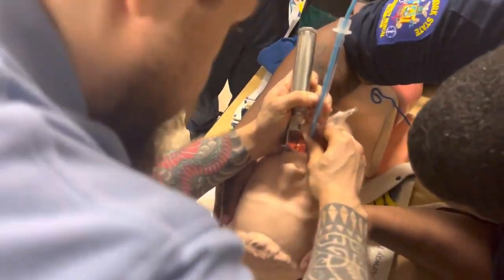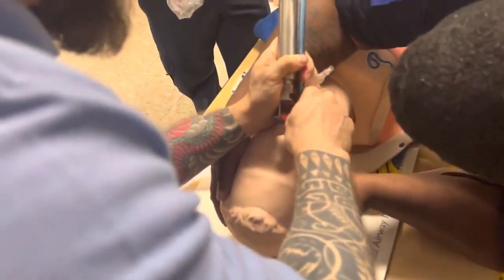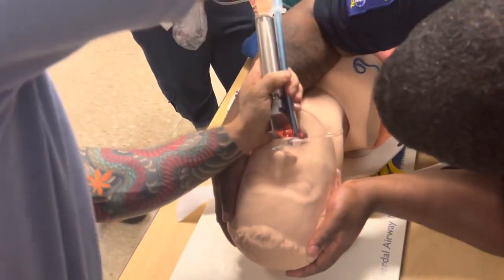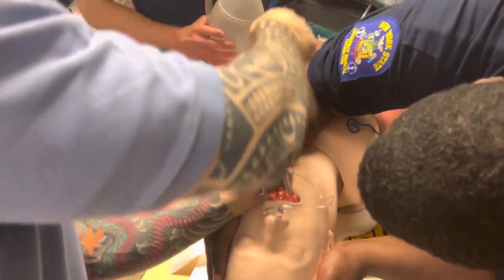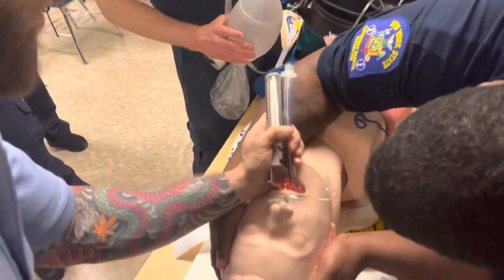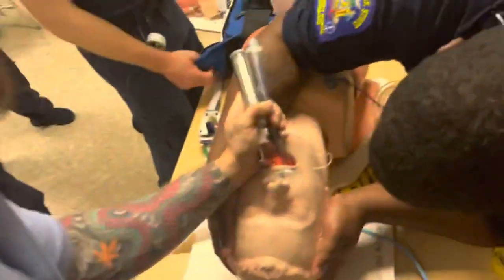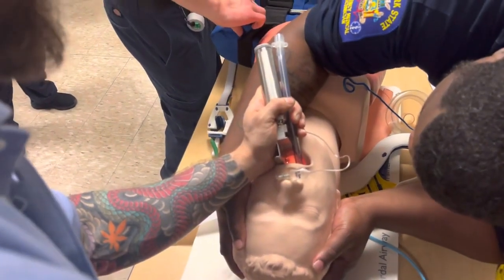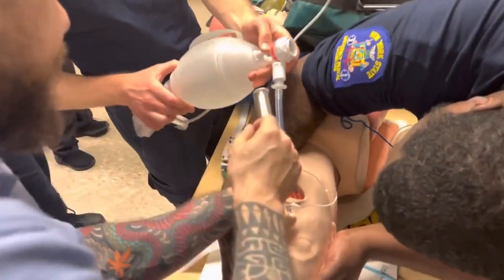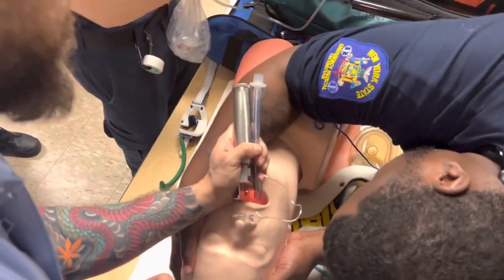That's all right. So I saw it go through, right? And now what I'm going to do is when I take out my bougie, I'm going to do it anatomically towards the feet, right? And what you need to put is the capnography, right? It might be in the ET2 kit, right? It might be. If it's not in this one, it might be in the one over there. We'll start here, just to get a breath in. It's important.